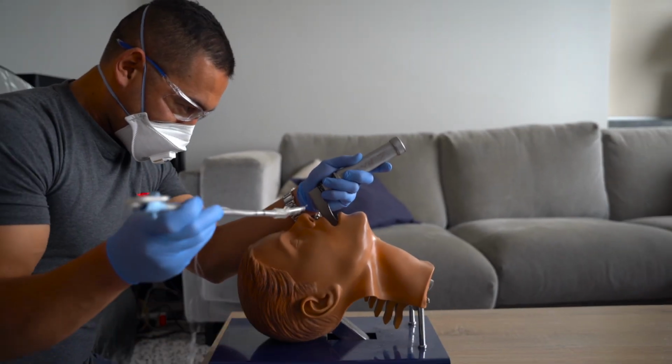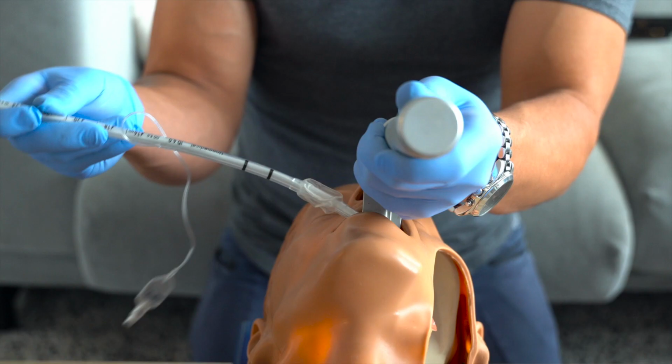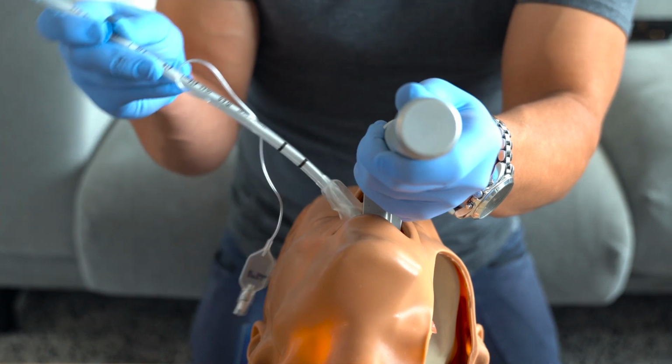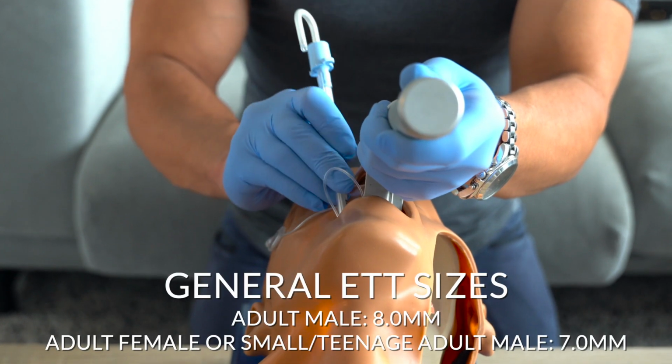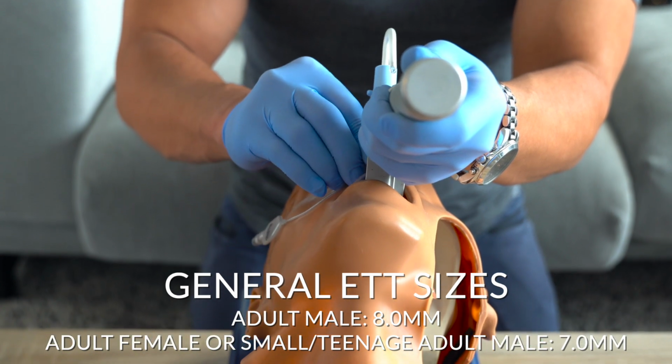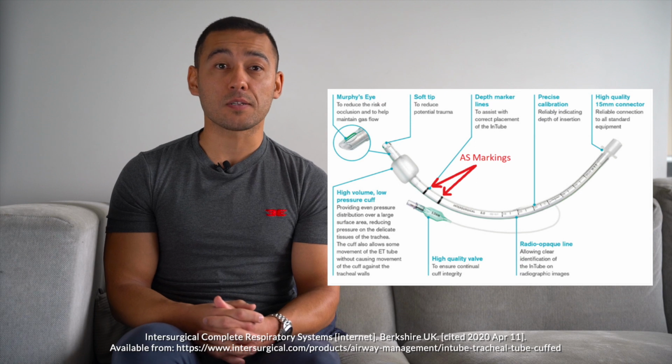In this demonstration, we're using a tube preformed with a stylet. It's straight to the cuff with a 35-degree bend at the end. Grasp the tube with your right hand and pass it into the mouth on the right hand side. It should be held on a significant angle initially to avoid obstructing the view of the vocal cords too early. Pass the tube through the cords and stop advancing when the vocal cords sit between the two black lines on the tube, which are the Australian standard markings.